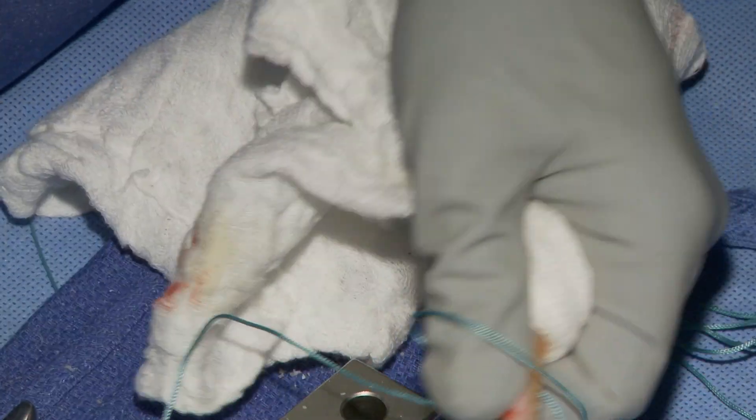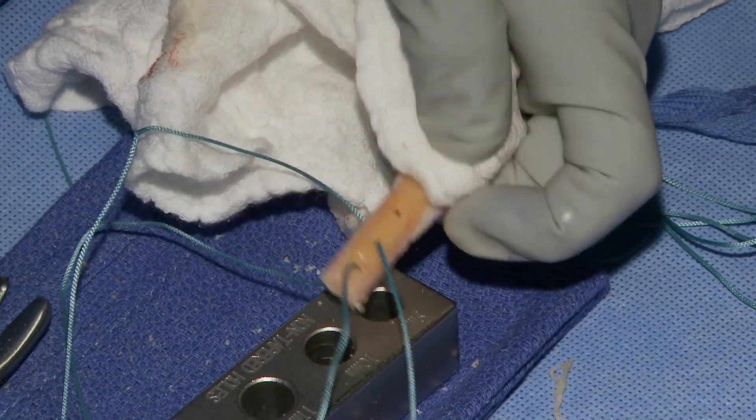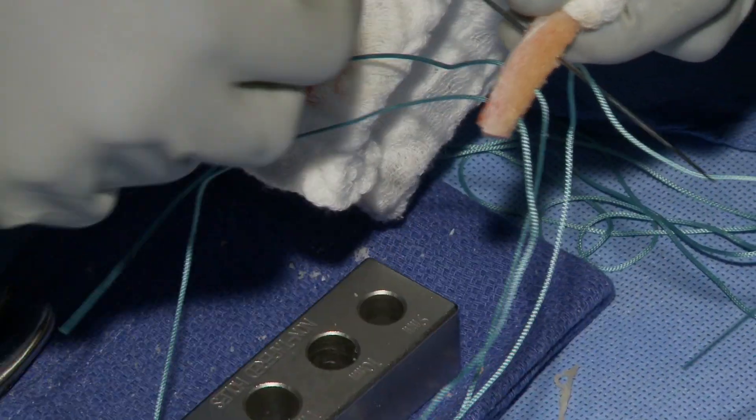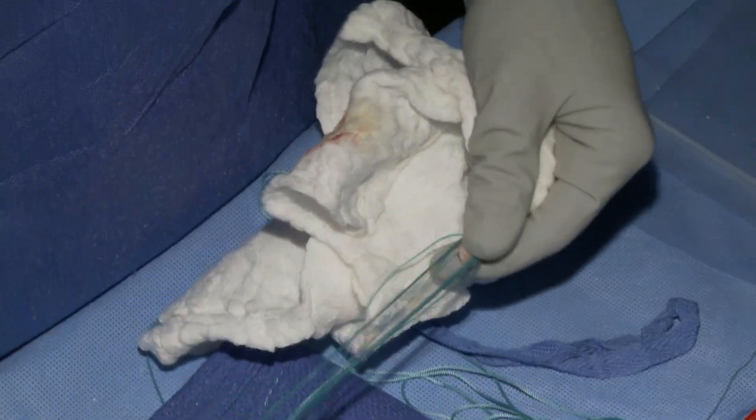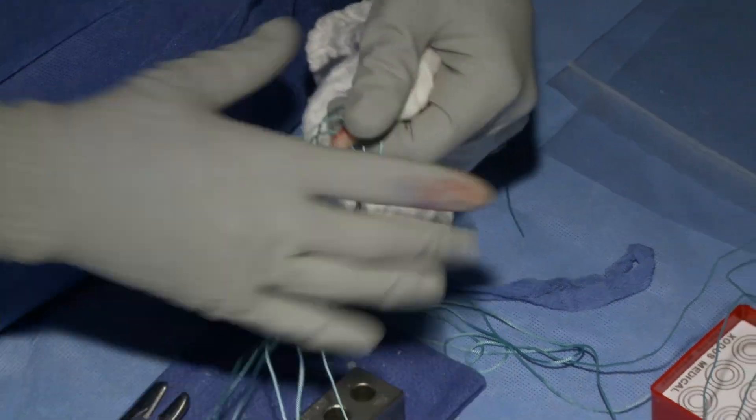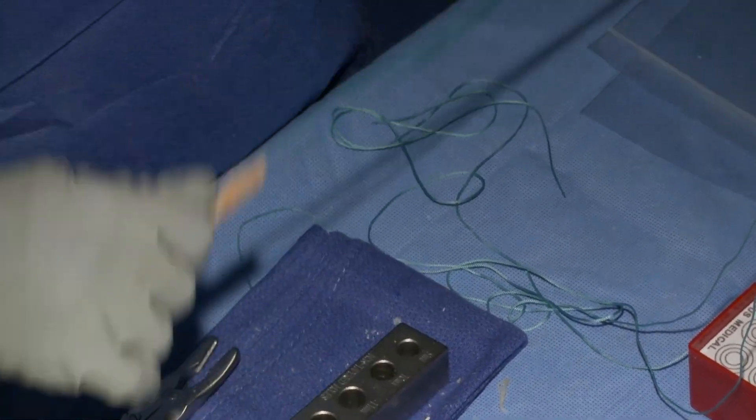You want to evenly space the drill holes, and I go at somewhat of an oblique angle so that when the attending is putting in the tibial hardware it doesn't catch each of the sutures. So you want one side of the bone plug to have a little bit more bone.